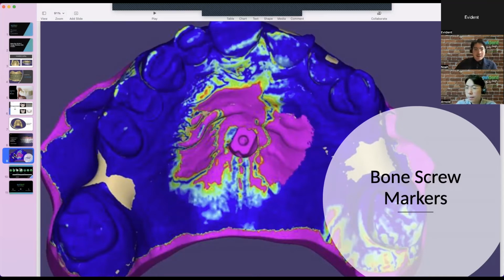I guess I'll take a crack at this one, Arnold. To start off with, you would need some sort of scanner to digitize your impression, whether that's an intraoral or a tabletop. We personally prefer the Medit series of scanners. They're amazing, super intuitive, great to use. But you'll also need either a way to design or a design partner.